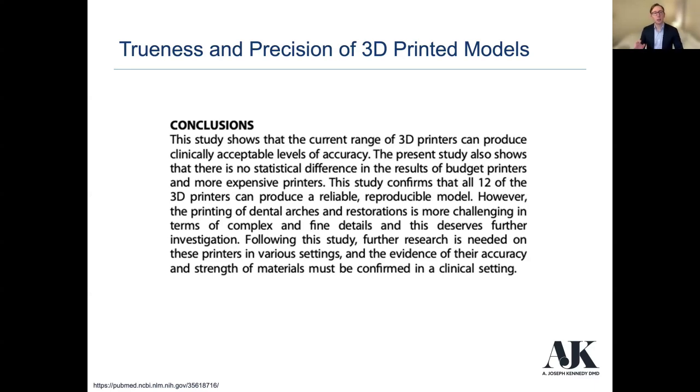What I will say is just a cautionary tale, and this is just my take on it, is that I'd be really remiss to use something that doesn't have FDA clearance on the types of resin if you're going to be using it in a patient.